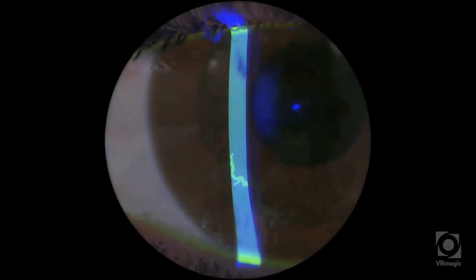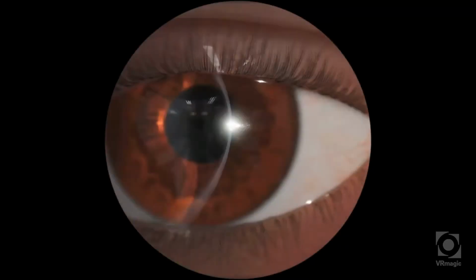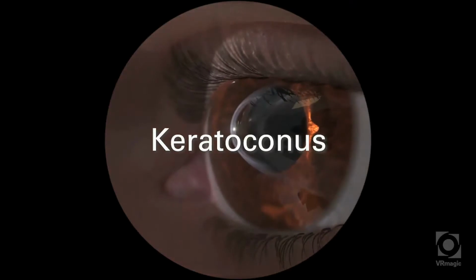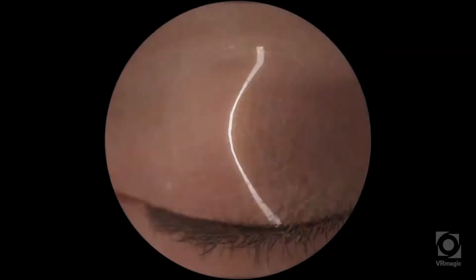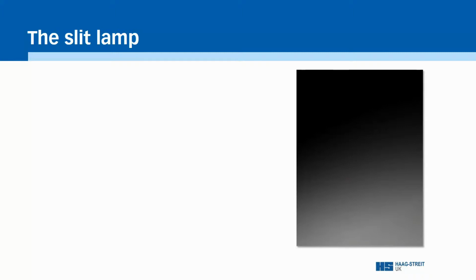With Eyesi Slit Lamp, students can examine a wide range of clinically relevant cases before they meet their first real patient. The simulated patient eyes are based on real patient histories and were developed in cooperation with universities and eye specialists. To provide an in-depth look at the functionality of Eyesi simulators, I'd like to single out our latest innovation, the Eyesi Slit Lamp simulator.